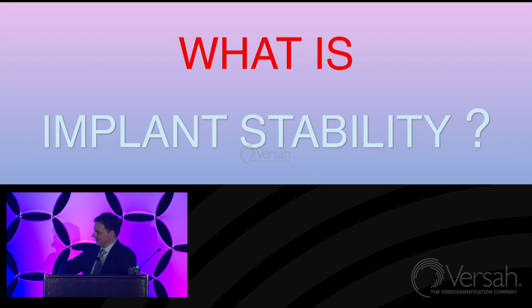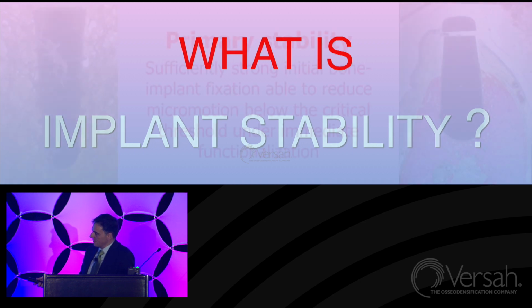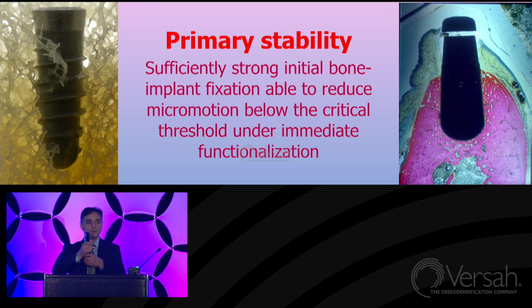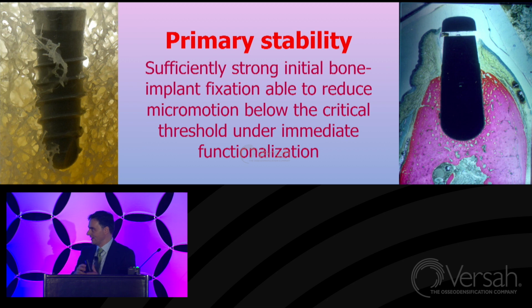What is it? Primary stability is a strong enough bone implant fixation initially. So it's something that we produce mechanically, like a carpenter, nothing else. We have a strong structure, we drill a hole, we fix a screw. This is like a carpenter, but we have to think like doctors. Okay? This fixation must be strong enough to reduce the micromotion at the interface.